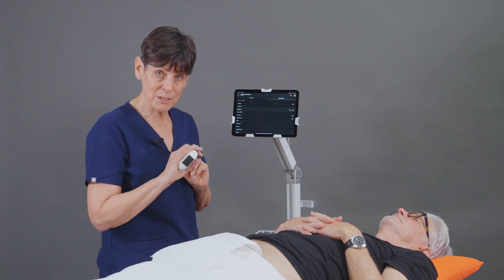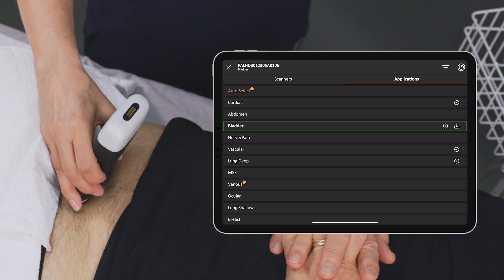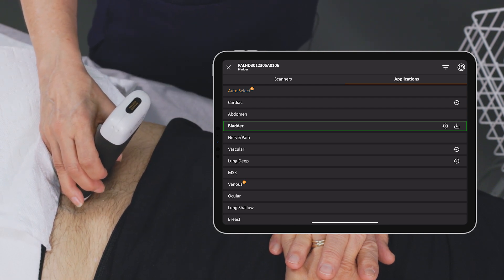I'm using the PAL, Phased Array Linear Scanner, and I'm going to place the scanner right above the patient's pubic bone, and I'm going to use the Bladder Preset.